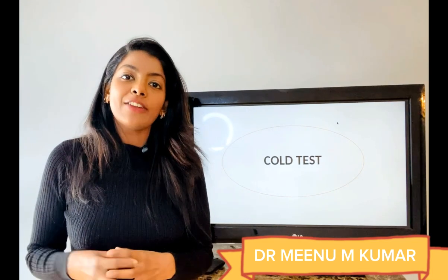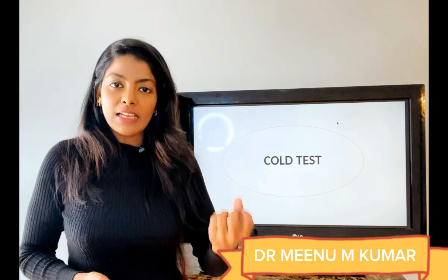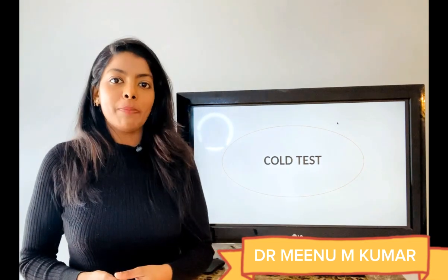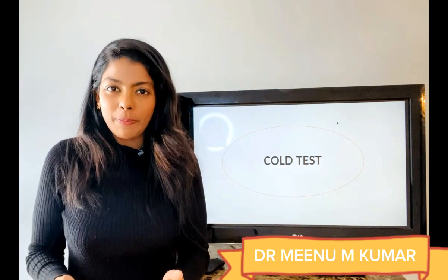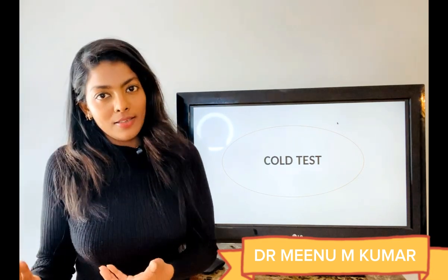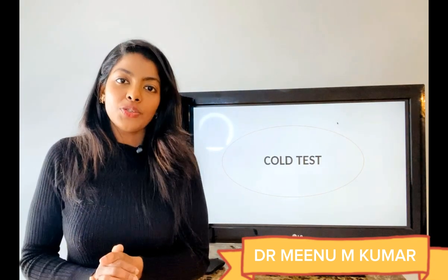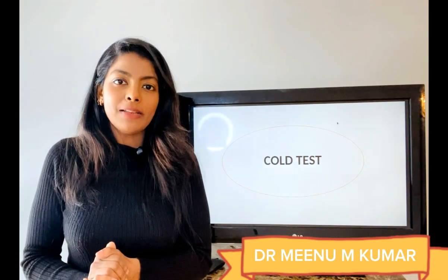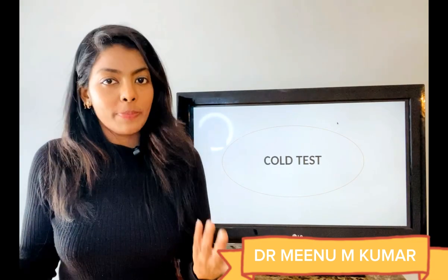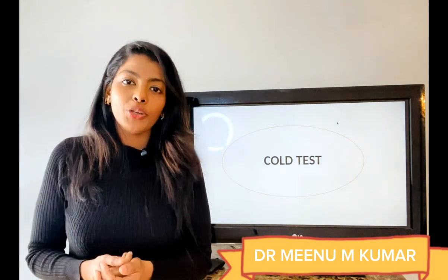The cold application is done for less than 15 seconds, following which we will get some response. The response can be either a pain which lasts for only a few seconds, then it might be reversible pulpitis, or it might be an immediate pain or a lingering pain, that might be irreversible pulpitis, or the patient gives a positive response comparable to the contralateral tooth, then it is a healthy pulp, or the response might be no response, then the tooth might be non-vital. But make sure that you perform other tests to confirm your diagnosis.